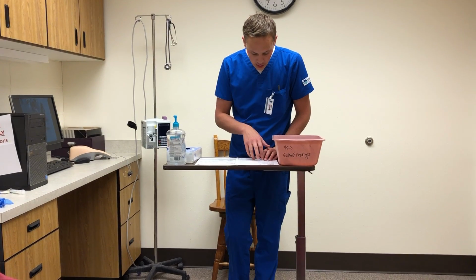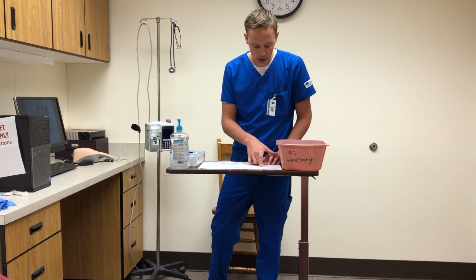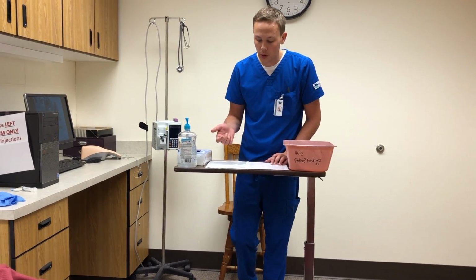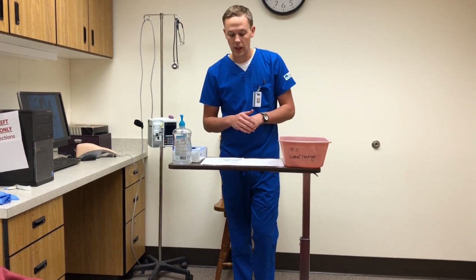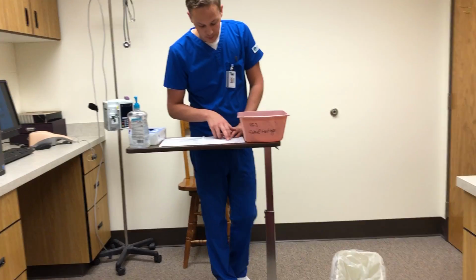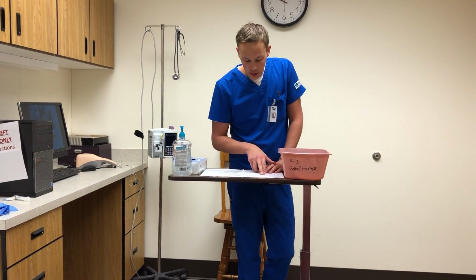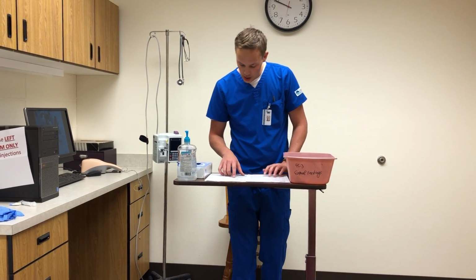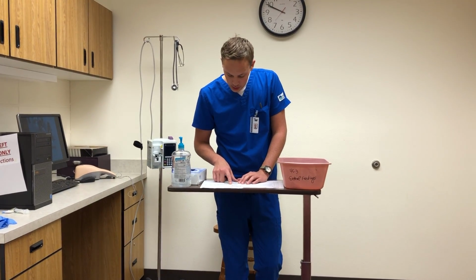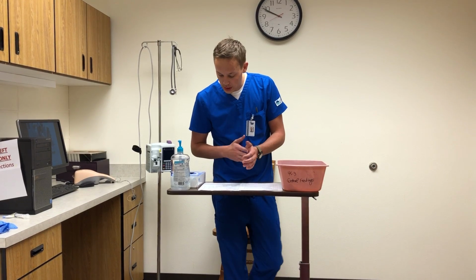Then next is Lispro U100 insulin pen with a mild sliding scale. So I know when it comes to administering that, I'm going to have to use a sliding scale to figure out how much I'm going to be giving. So I have the sliding scale subcut 3 times a day with meals, and here on the MAR, Lispro U100 insulin pen, mild sliding scale subcut 3 times a day with meals. So I know that that's all correct.